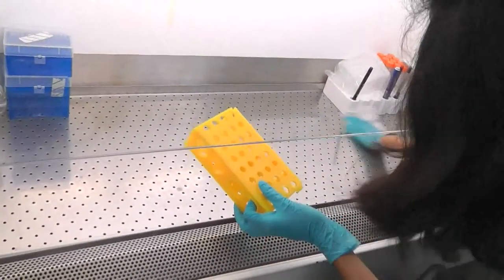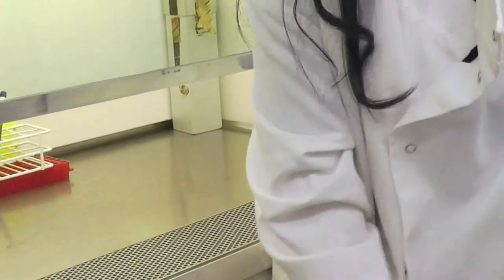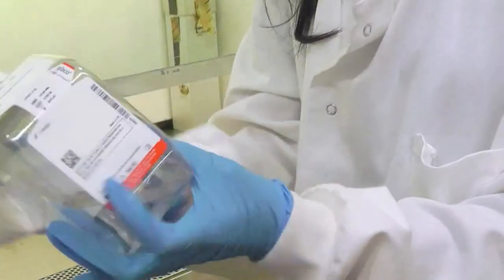Finally, sterilising the materials that you will use, such as media bottles, is recommended, as there is a risk that they may have come into contact with contaminants during storage in the fridge.